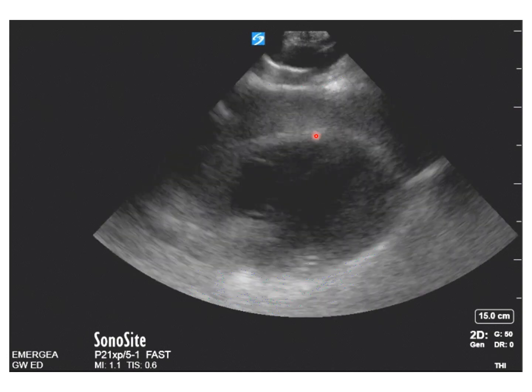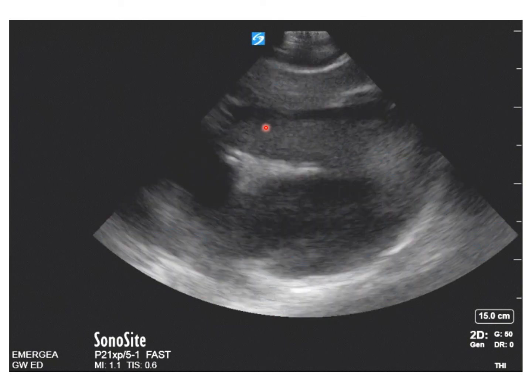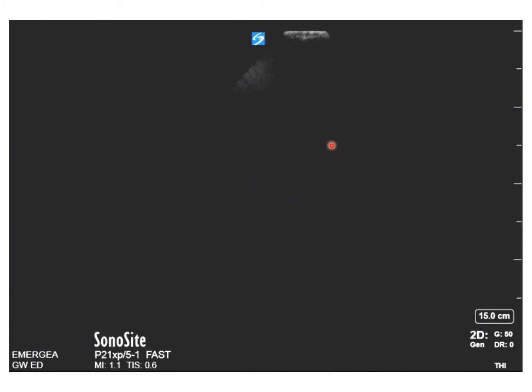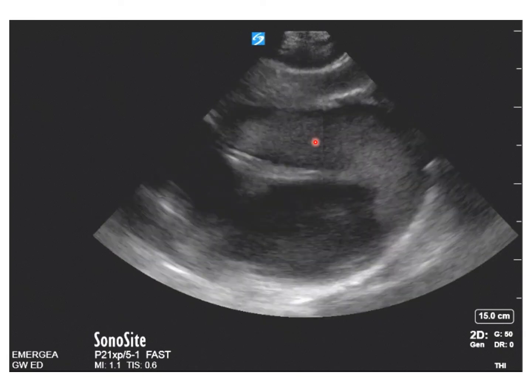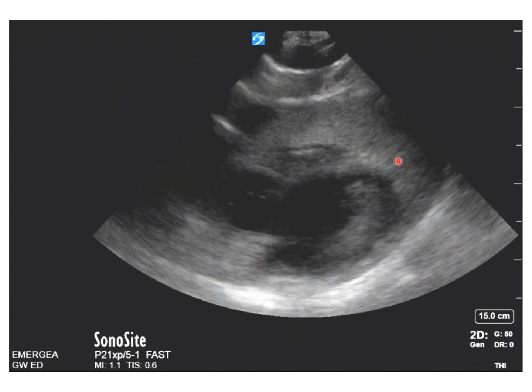So that is clotted blood in the pericardium. And because the blood clots and gets more dense than fresh blood, it starts to have an echo texture that actually looks pretty similar to myocardium, and it may look like normal heart muscle with a small effusion, as opposed to what it actually is, which is a fairly large effusion that is just also clotted.